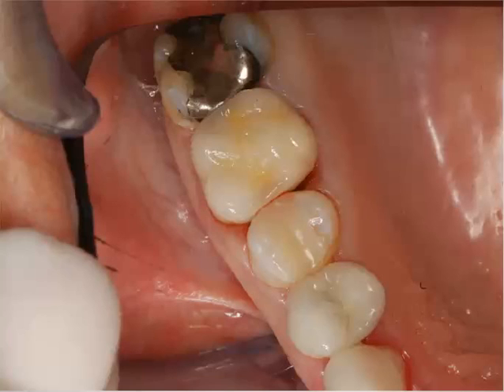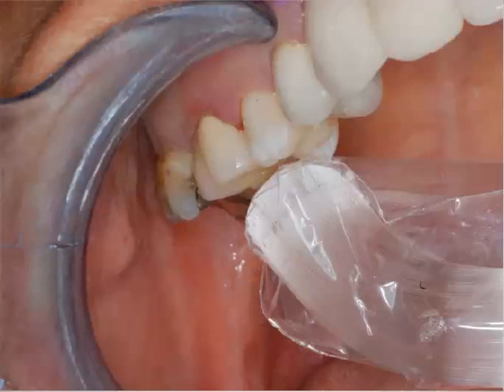Cover the margin, and then when you place it in, you're simply going to toggle it back and forth. Very easily, the excess cement is expelled. Run through your floss, hold it in place. Clean up the excess. I just clean up with a cotton roll. That's all you need to do. I don't let it go to a gel stage and try to pick it off. It removes very easily. Then we're going to go ahead and light cure it.